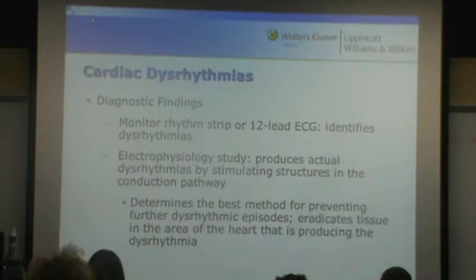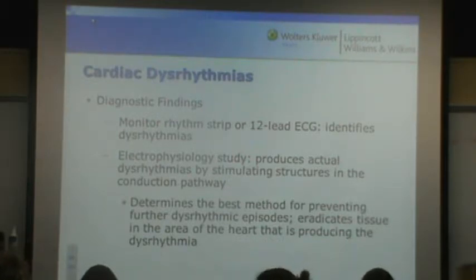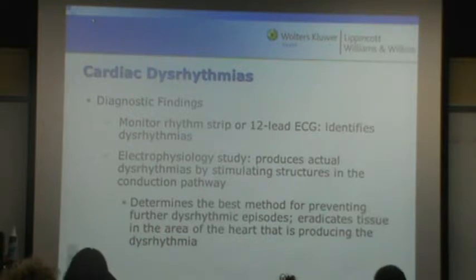It's really, really great to have a 12 lead available, okay? Oftentimes we only have the monitor strips like what I was handing you, or that's what we have initially. So a lot of times we can look at our rhythm strips and make a determination of what we think it is. But the good thing about a 12 lead is that it will actually interpret the rhythm for you to kind of confirm. But it's like any other piece of equipment, it can be wrong. I've seen them make mistakes before.